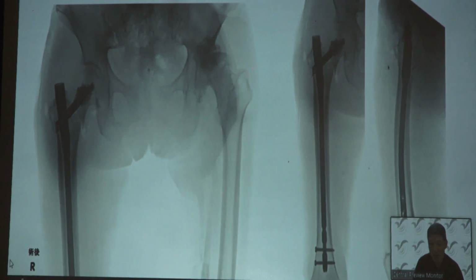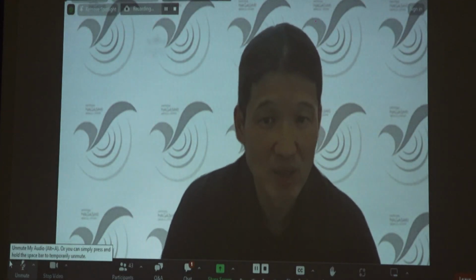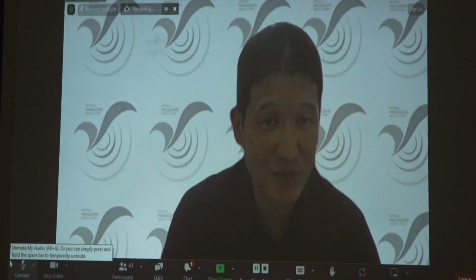And what's funny about it is once you have your nails in, your greater trochanter did not fall apart. The only part that is going to be missing is the lesser trochanter, because it's attached to the iliopsoas, and the pull force of the iliopsoas is so strong that it's going to displace it anyway, whether you have your reduction or not. So the only thing that matters is your placement of the greater trochanter. So put back your greater trochanter where you want it and see the tip of the greater trochanter, and then start shooting down the guide wires. I think it's recommended. Have I answered your question?